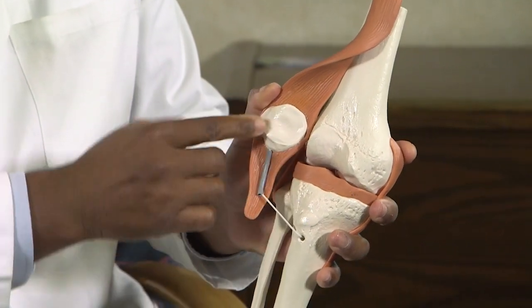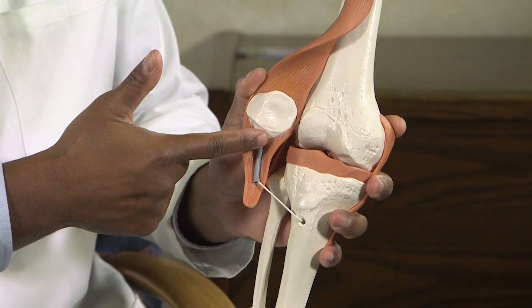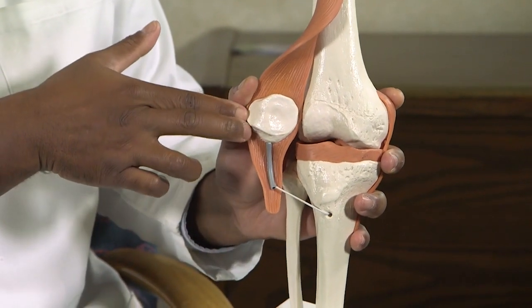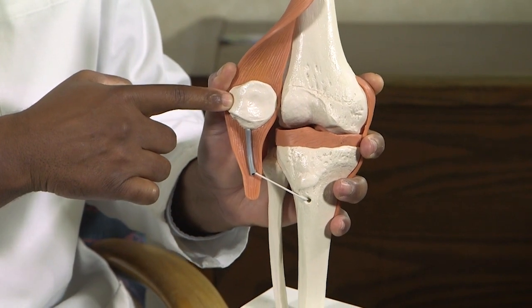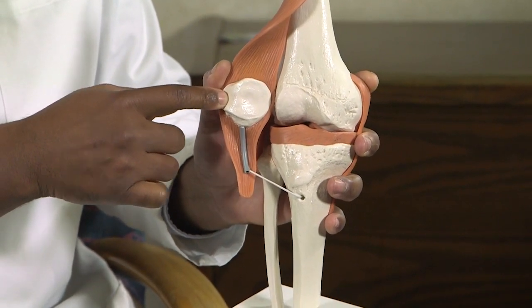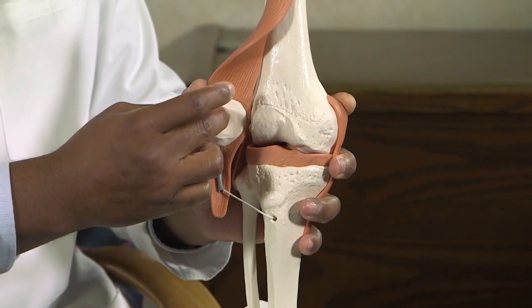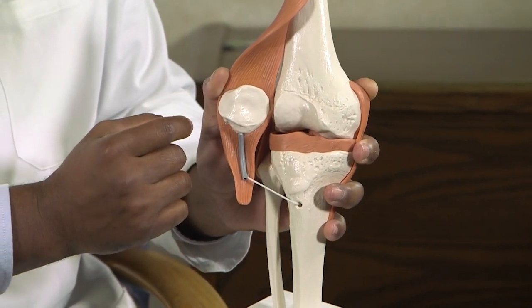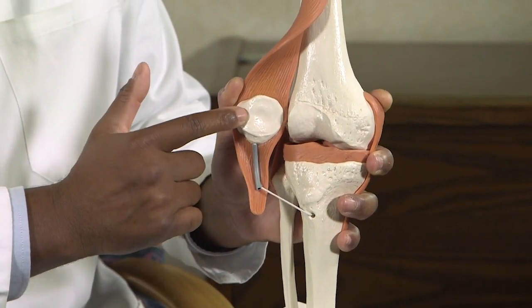Most surgeons will resurface the back portion of the patella, which means using an instrument to remove the worn down cartilage and subchondral bone and prepare it so that you can cement or glue a plastic patellar component to the back side of the kneecap.